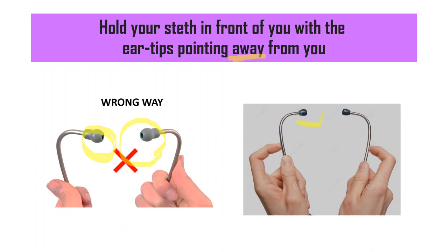Instead, what you should do is hold it in such a way that the ear tips face away from you. When the ear tips are pointing towards you, you can see those hole-like structures facing you. But when you hold it the right way, when the ear tips are facing away from you, you cannot see that hole. This will be the right way of holding it.